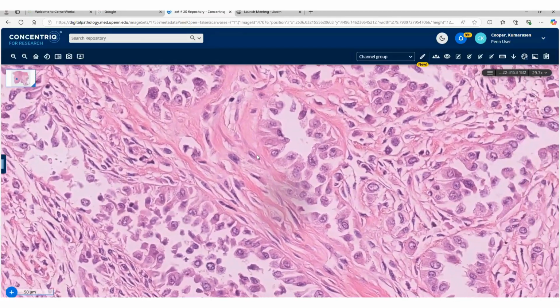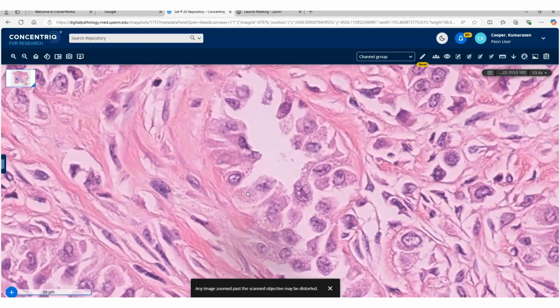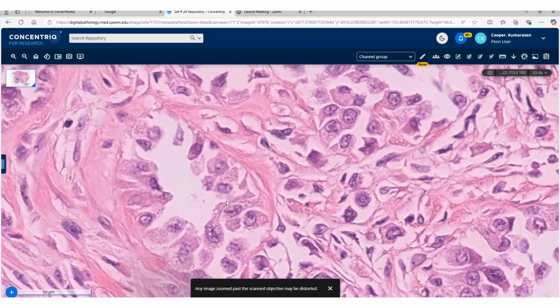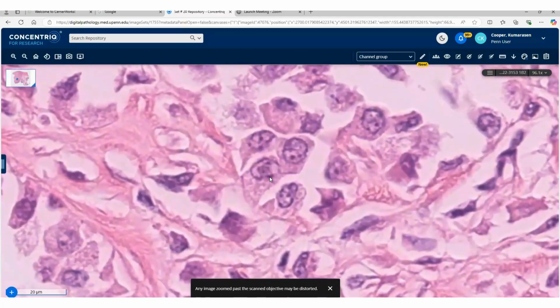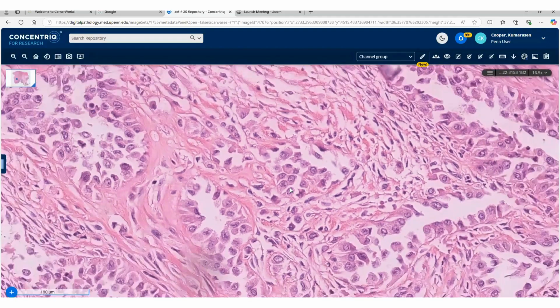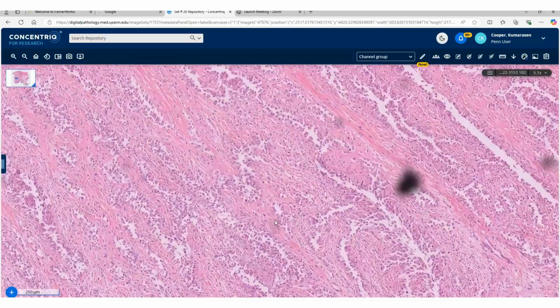If we go down anywhere, they're pretty similar wherever we go. You can see these large tumor cells. They do look sort of columnar, but like I said, these are not epithelial, just to help you along with that. Large nuclei, and this is about as close as we can get to it. Vesicular chromatin, some of them having a nucleoli. And again, that's a nest, and this is a trabecular component, which I've already mentioned.